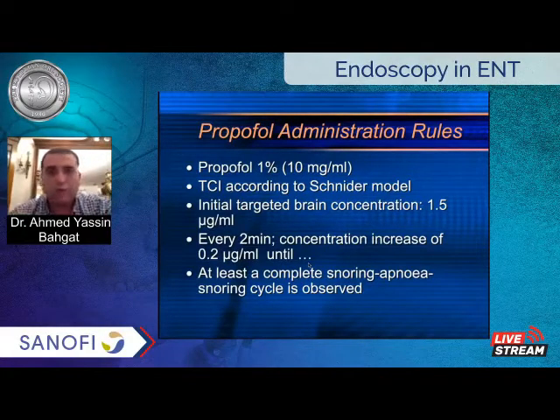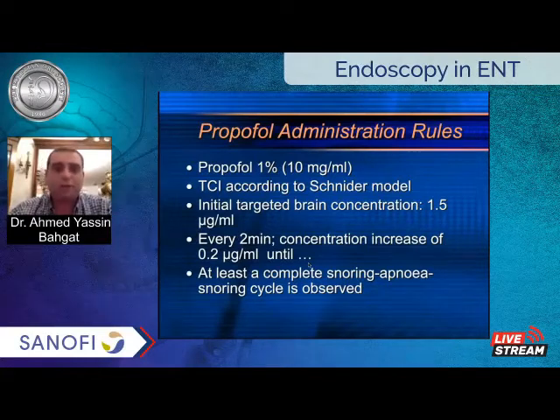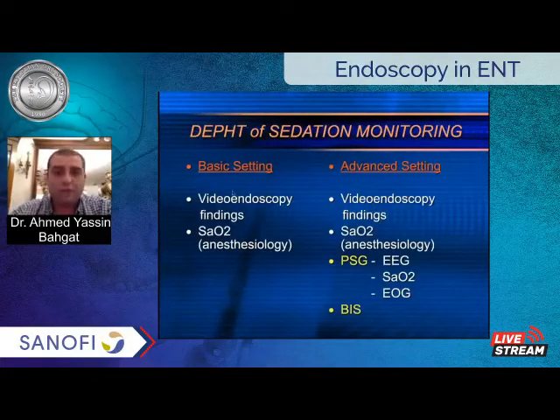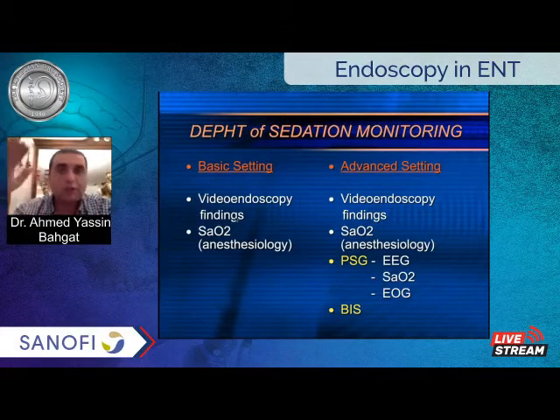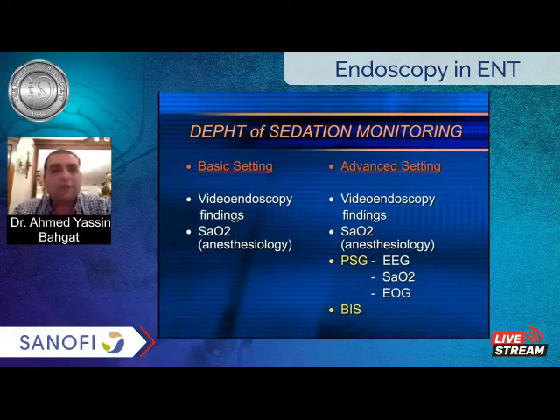I'll tell you how to know that you are at the proper level of sedation. Here's how to know the depth of sedation. If you have the basic setting, you can judge by the endoscope or by the oxygen saturation. Or if you have an advanced setting, you can judge by polysomnography or BIS. When the oxygen saturation starts to drop below 90, you are now in a state of apnea, so you start to judge the airway at that time.